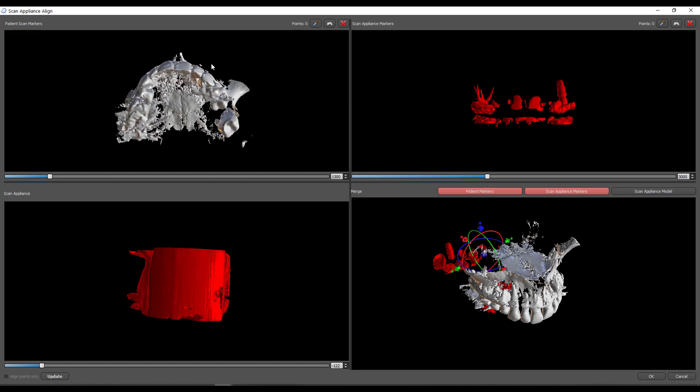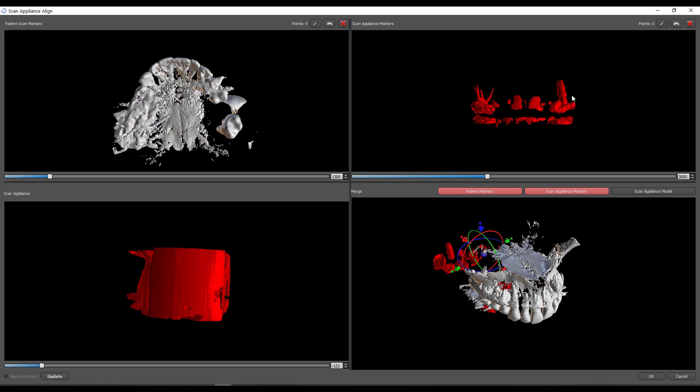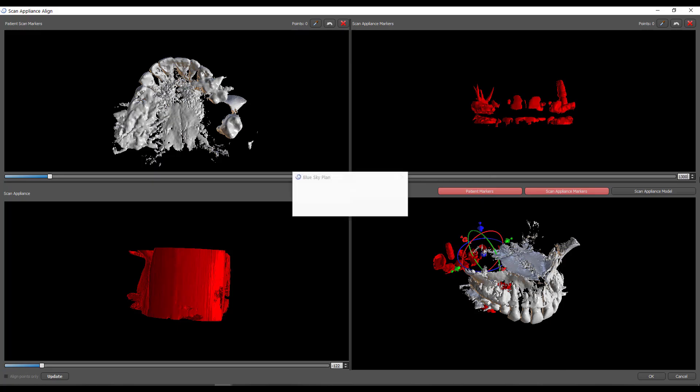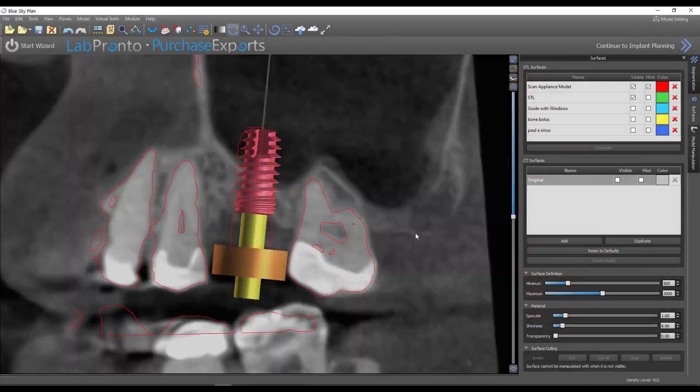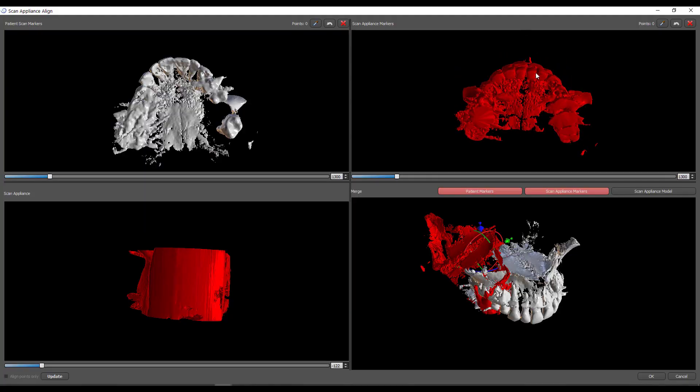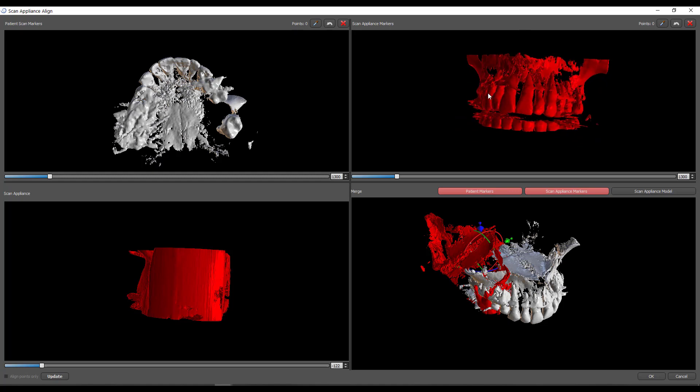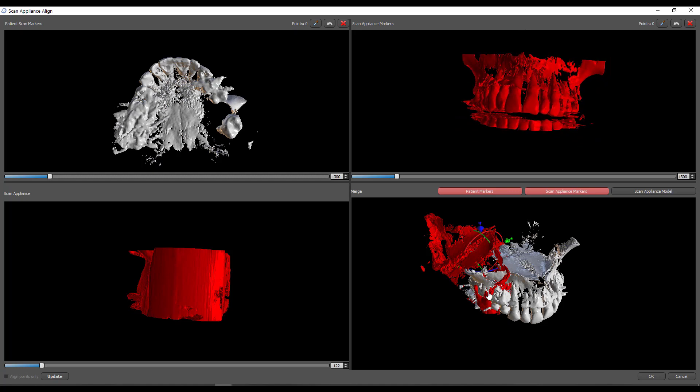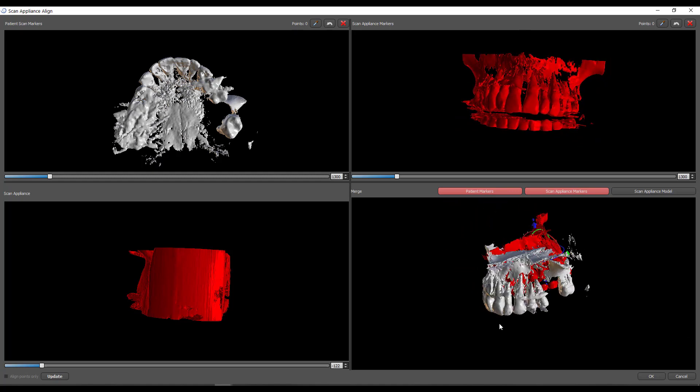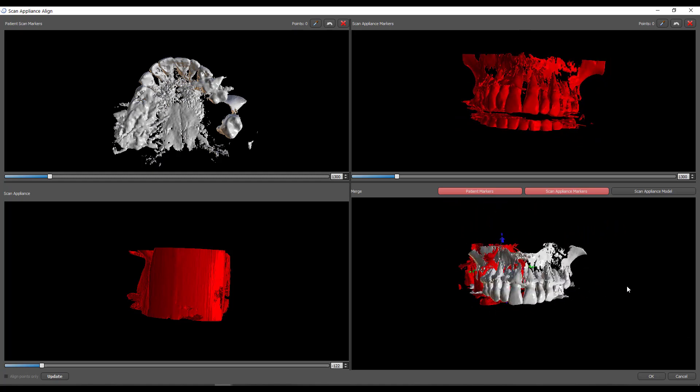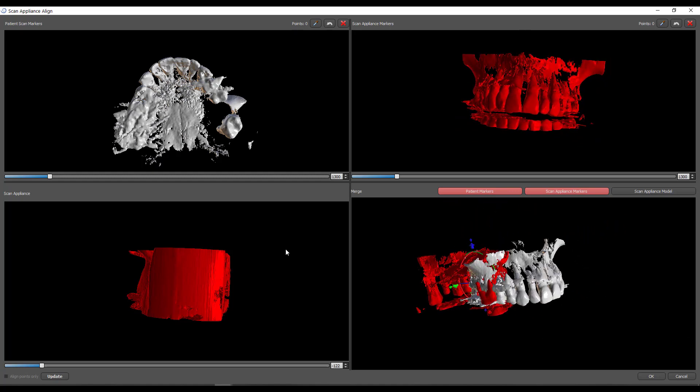And so remember, this is the same patient, same volume that was scanned, and so the setting should be pretty similar. So I'm just going to change this to 1300 as well. So the renderings look very similar here. So now we're ready to stitch them. Obviously, you can see down here in your stitch preview that these are not matched up.